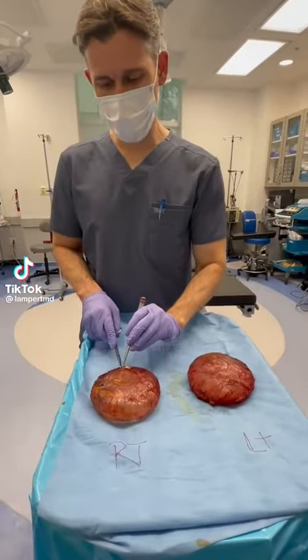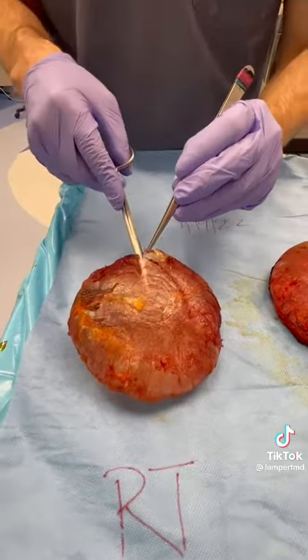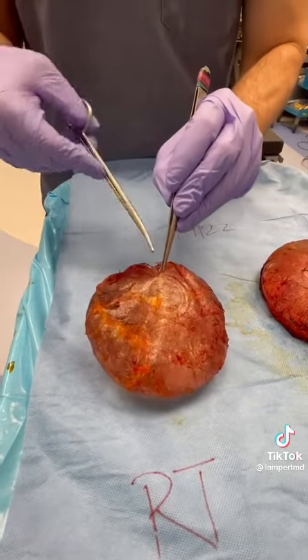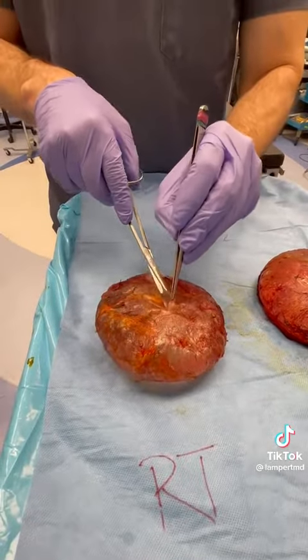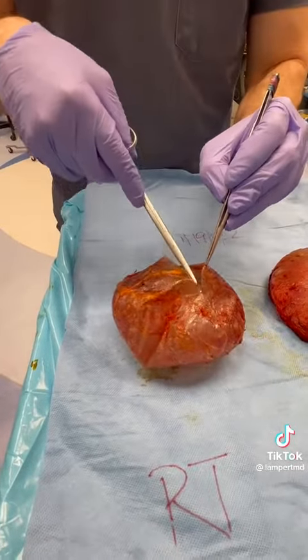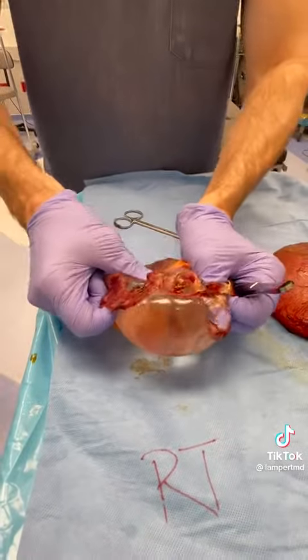So we did two en bloc capsulectomies today. This one we did a breast lift and fat transfer at the same time to minimize post-operative deformity. And no rupture, so that's good. These are a little dry — they've been sitting on the back table.